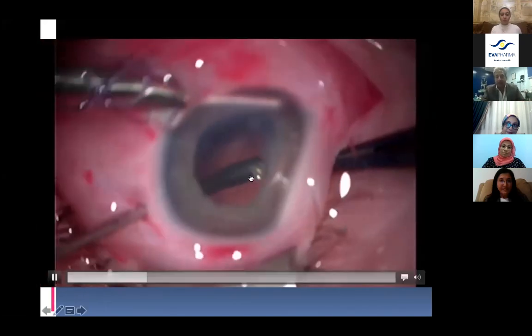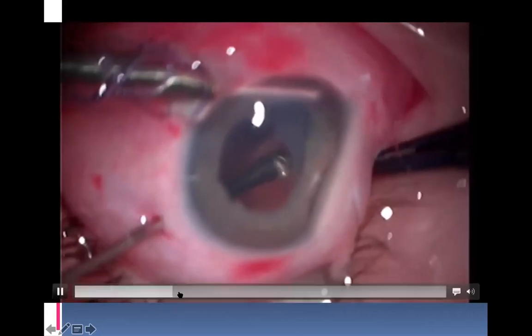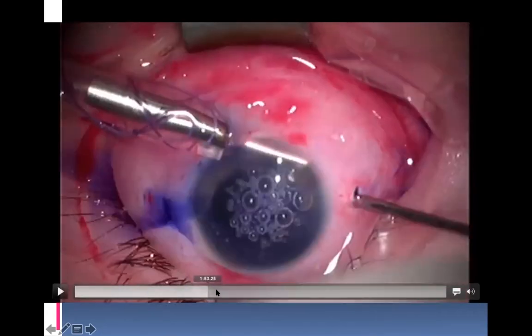So what we do is try to isolate a plane where you differentiate the dense epiretinal membrane from the retina. This is not as easy as it seems, but we have to be ready to do this for posterior and anterior segment pathology. We identified the regular trypan blue as a helper in the differentiation of such pathology, and in the normal retina, you can identify the disc here. There were chorioretinal adhesions here. The vitreous was adherent to the retina. I was really trying hard to isolate it, wondering what the heck was this? What am I dealing with?